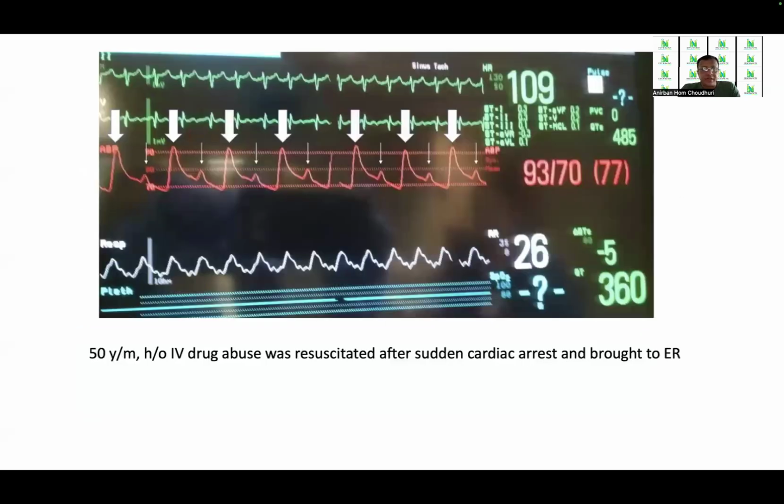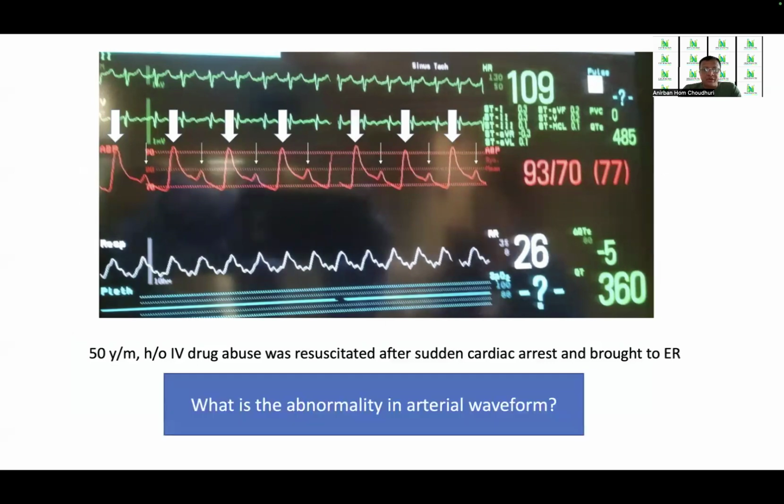Now look into this. This is a 50-year-old male, with a history of IV drug abuse, who was resuscitated after a sudden cardiac arrest and brought to the ER. So what abnormality is present in this arterial waveform?